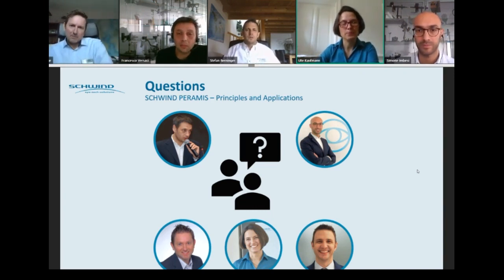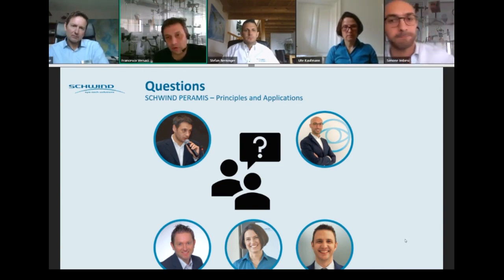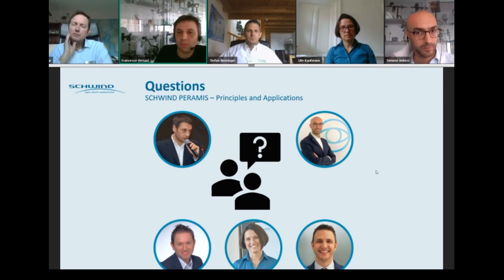Yes. By definition, the internal aberration is nothing but the difference between the total wavefront and the corneal wavefront. So if I can measure the corneal wavefront and I remove it from the total aberration, I will have the impact of the internal part of the aberration. And this is very useful, for instance, when you try to measure the tilt or rotation of the toric IOL, or when you try to measure the impact of some internal components to the eye.